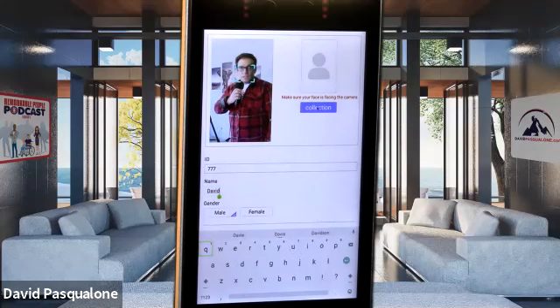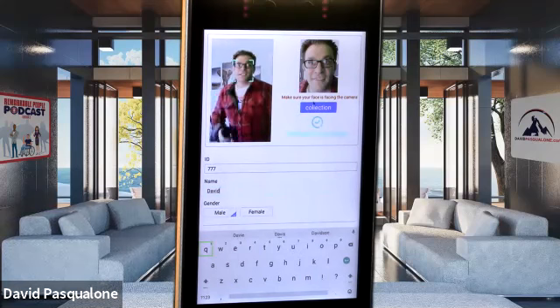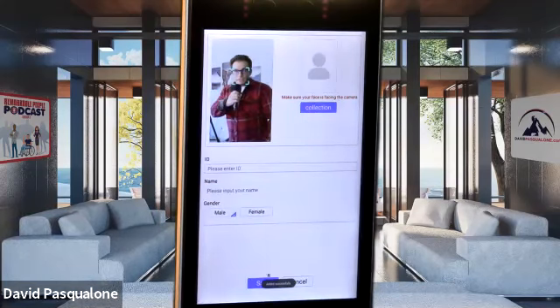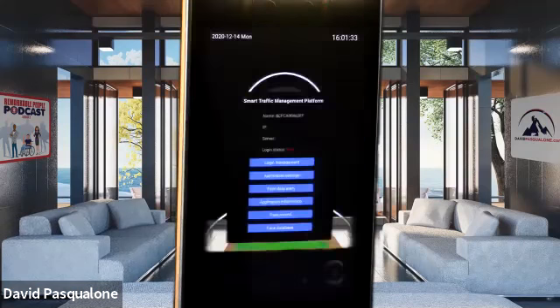And then make sure your face is facing the camera. I'm going to put the mic down for a second and hit collection. Now, what I see from that is I am an ugly man who needs a hair transplant. But as far as the facial recognition is concerned, it has my picture. So I'm going to right click, scroll down, hit save, and hit cancel, because this is if I was going to add other employees back to back, you just have them stand in a row, but we don't need that.